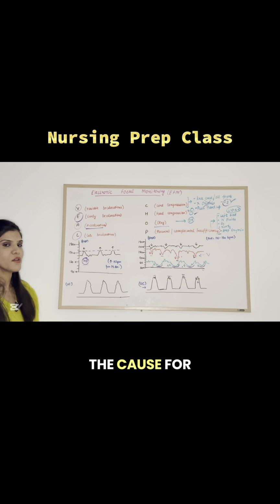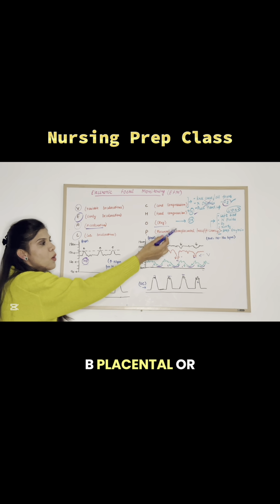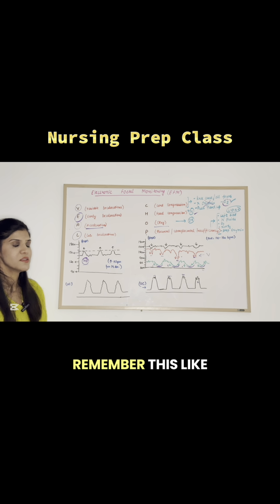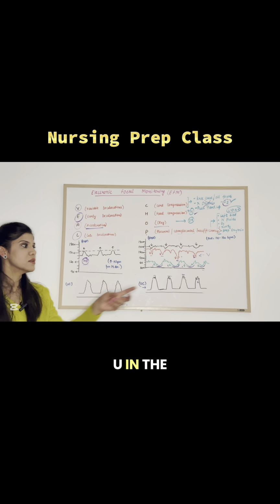Now, what is the cause for late deceleration? The cause is P, placental or uteroplacental insufficiency. You can even remember this like uteroplacental insufficiency, so you see U in the graph.